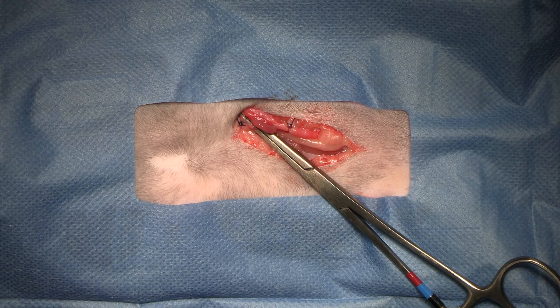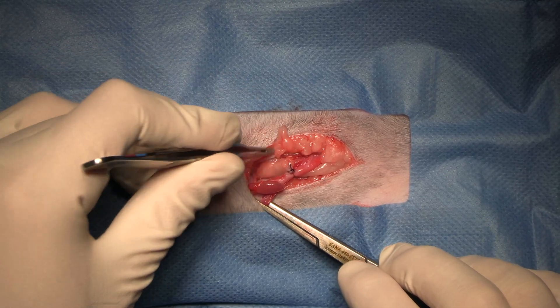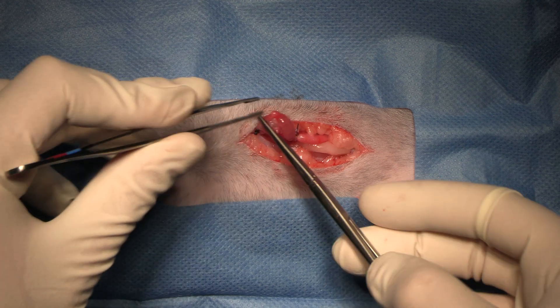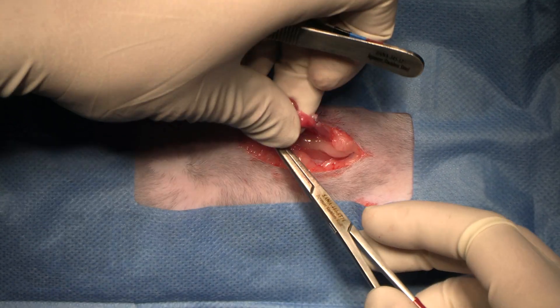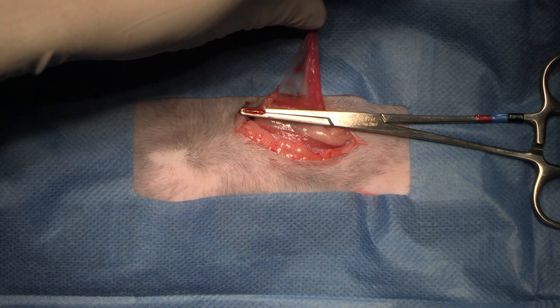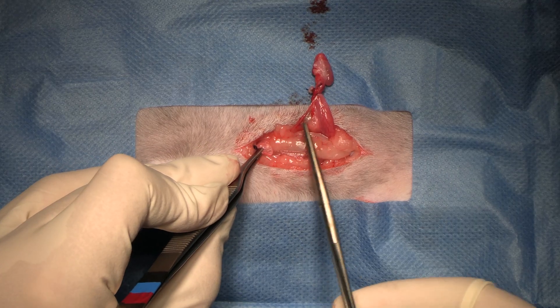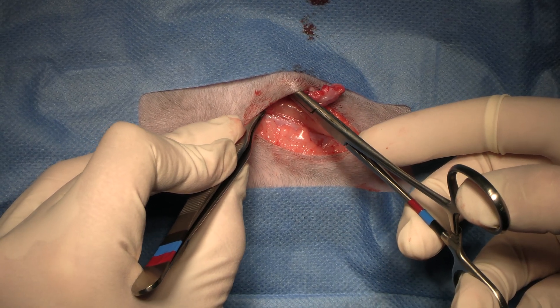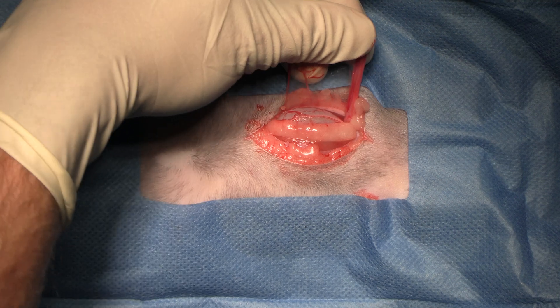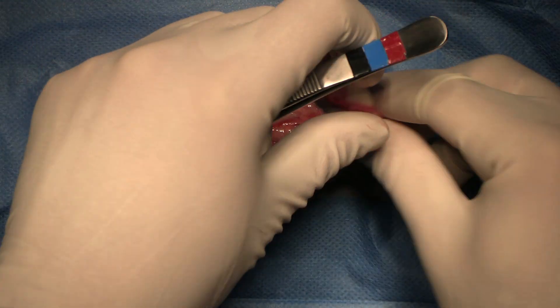We do our checks as always — make sure that our ligature is not stuck in any subcutaneous tissue. There's a little bit there, so we just flick it out. We make sure it looks nice and tight. In the cat there should never be any question — we've got plenty of tissue above our ligature. Run along the top of the hemostat. As always, we carefully lower the ovarian pedicle back into the abdomen, watching for bleeding. We check the broad ligament, make sure there are no vessels there — you can either digitally break it down or just use scissors, always away from that uterine artery.